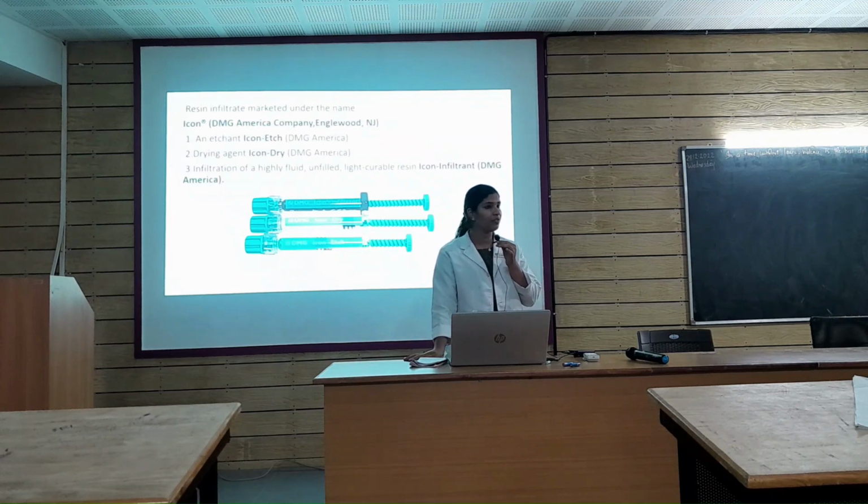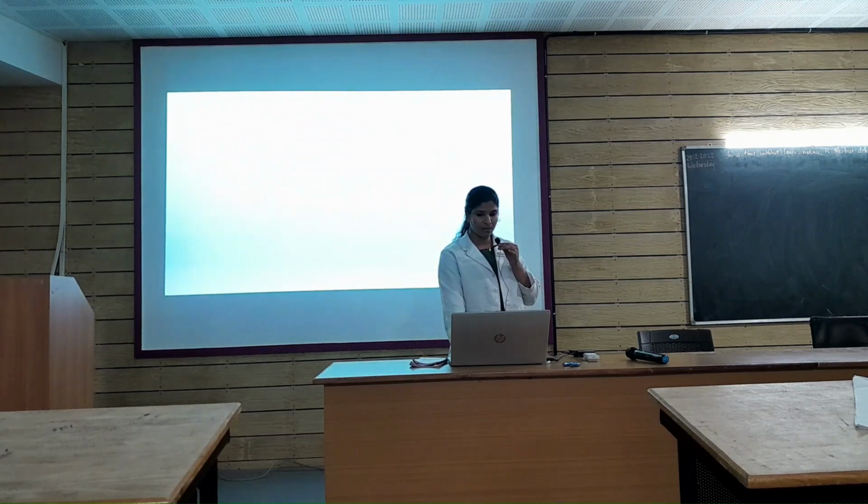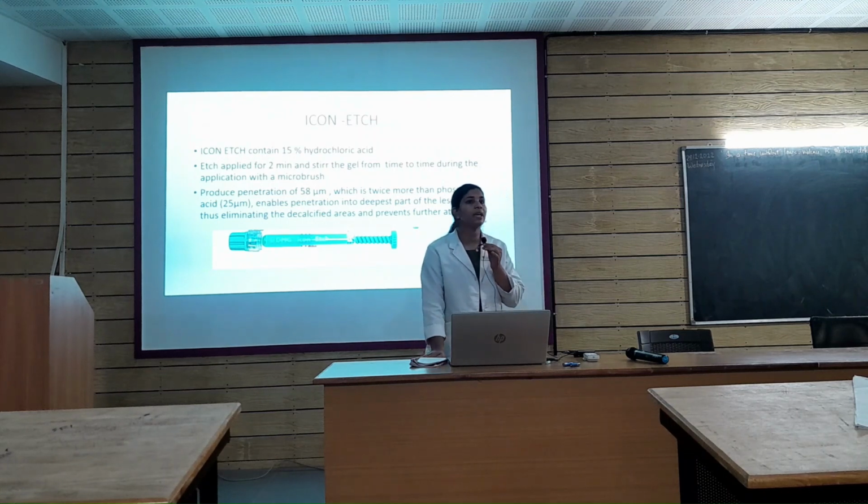The resin infiltrate has been marketed under the name Icon, and it consists of a pack of 3, which contains an Icon etchant, Icon dry, and Icon infiltrate, as I will explain later in the techniques. In the technique, the first one is the Icon etching.